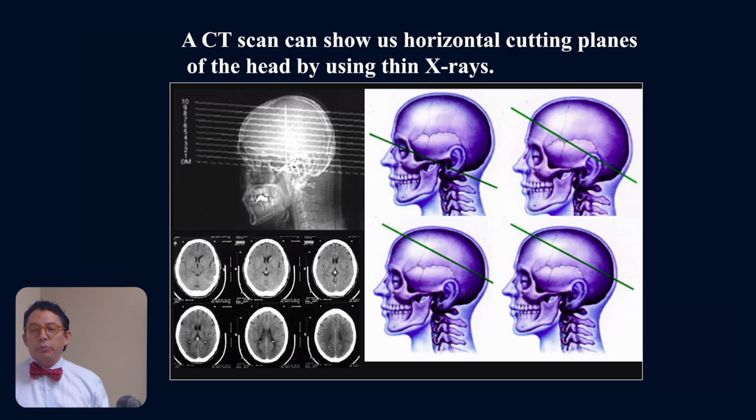But nowadays, technology has improved so much that the volume elements that we're receiving from the scanner can have the same depth, width, and height. So if you have a little cube that has the same depth, width, and height, and you have multiple of those per slice, and you have multiple slices, you can reconstruct the same slice in different planes. So nowadays, we can reformat these in different planes that we couldn't in the past.